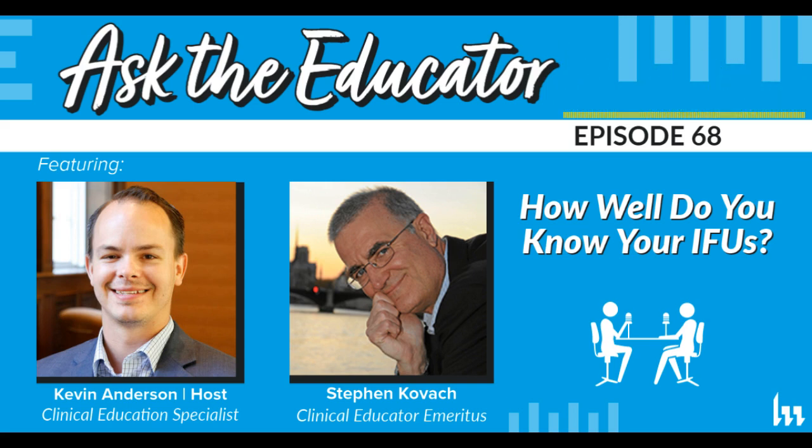And I don't see anybody checking continuity, all of which is in there. Well, the auditors didn't come and ask me about it, so it's okay, and I don't hear of any problems in the OR. Just because there are no problems doesn't give you the right not to follow the IFU. This is one example. I've got 2 or 3 more I want to throw out in this short time.